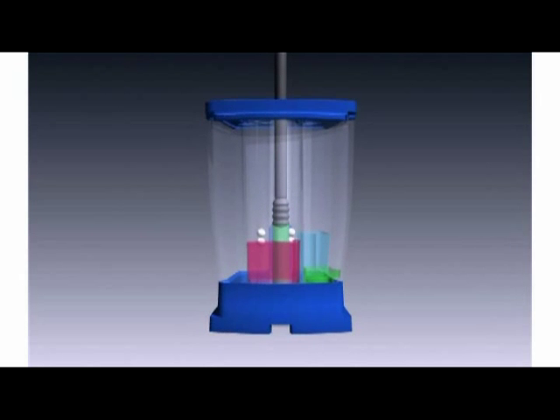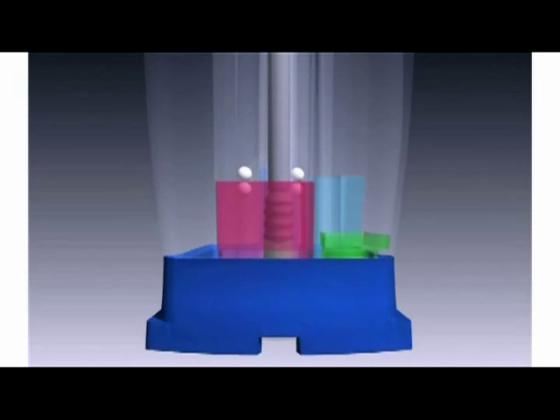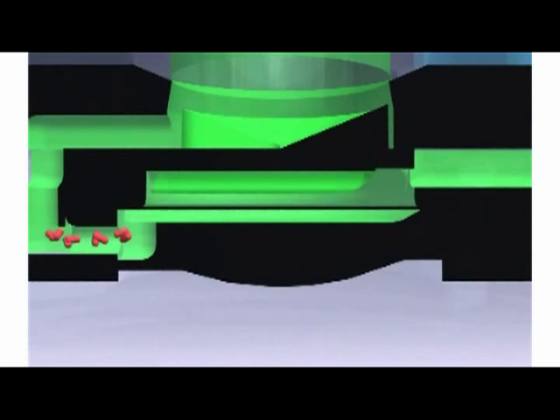The valve body rotates to position two and dispenses the sample through the active area. Here we see the organisms being trapped on the filter, while the remaining fluid is dispensed into a waste chamber.